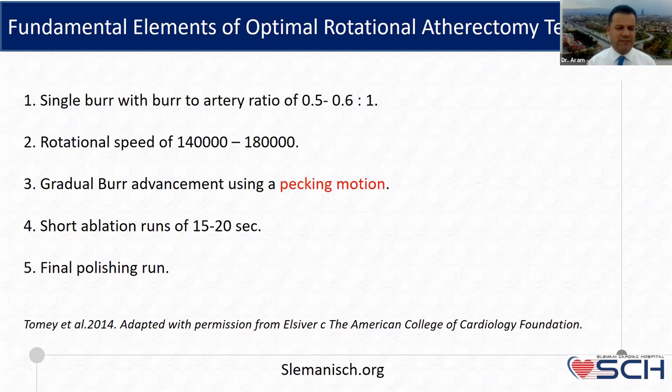And actually, it's mentioned that it's better to have a final polishing run. In the vast majority of cases, we are not going to do just one or two. Sometimes we are going to make several passes, going along the guide and coming back through the lesion. Because as mentioned by Dr. Amjad, this is not only debulking, it's plaque modification. That's why this case needs a final polishing run.